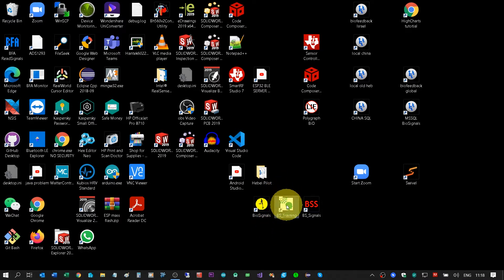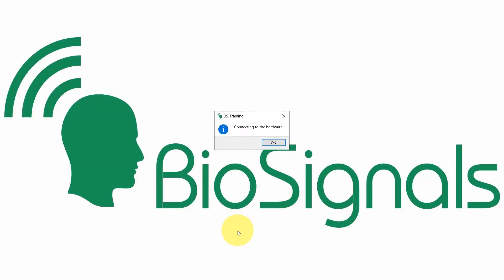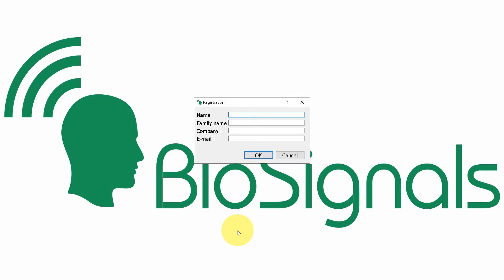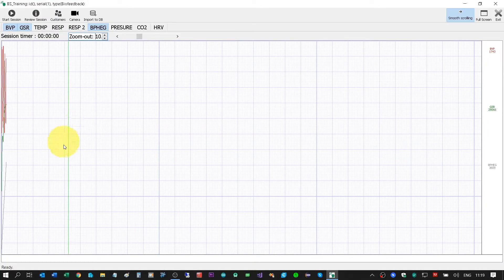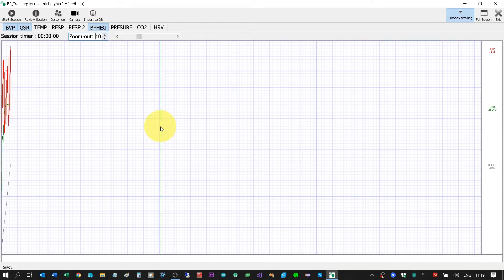Let's start with the BS Training app. Double click to open it. For first login, we need to do registration with our own email address. I'll click OK to verify this is a registered product.